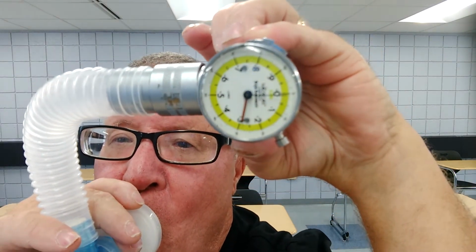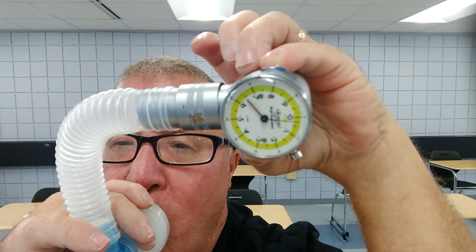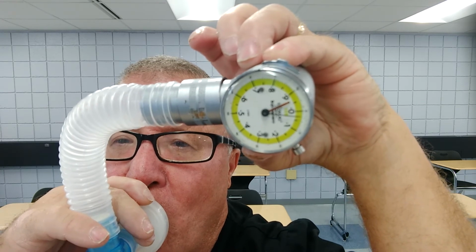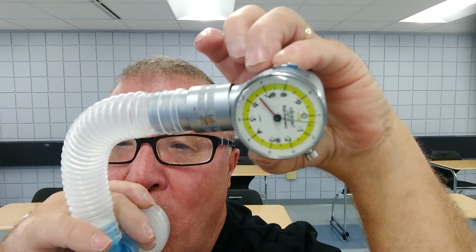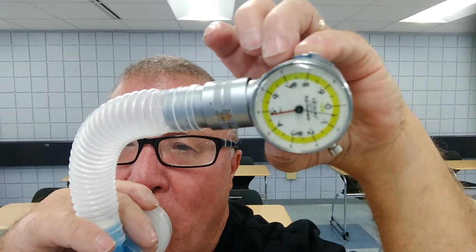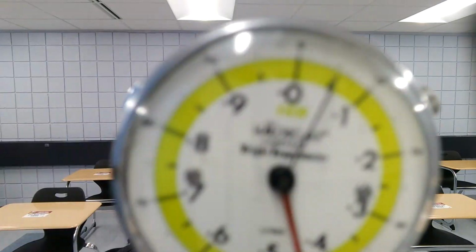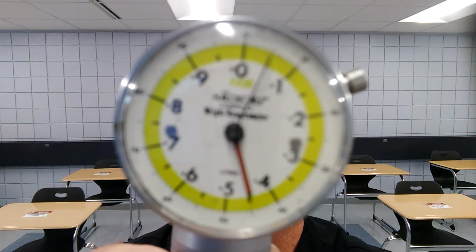Once it's been 1 minute, I take it off the patient, attach them back to the ventilator, and then I'm going to look at my numbers. Okay, now if you look at this number here, it's hard to see with the screen.